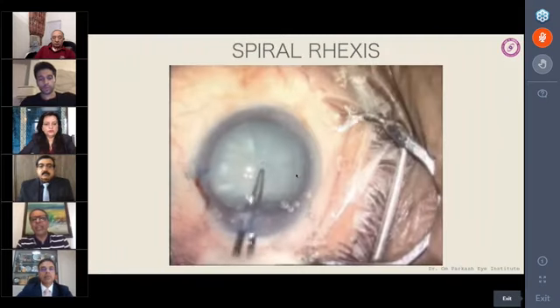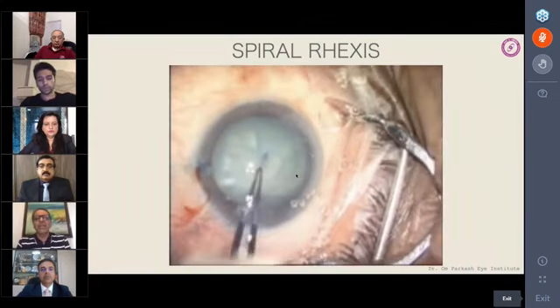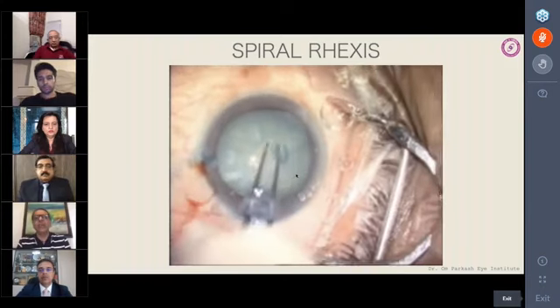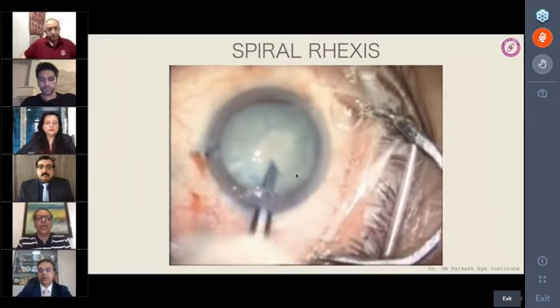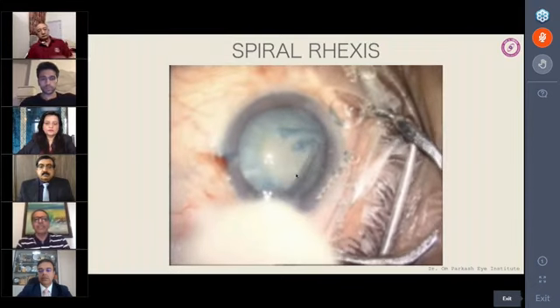Next is, at times we think that it is an intumescent one, and we find that it is easy and we can complete the rhexis. Then you can spiral it around. So this is a very old video, and I've been doing spiral where I find that it is not really intumescent with the cortex fully liquefied.